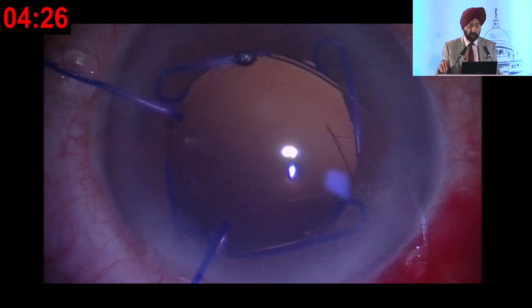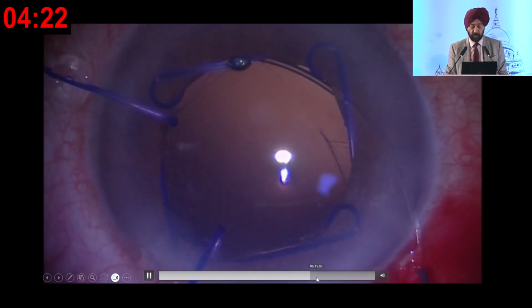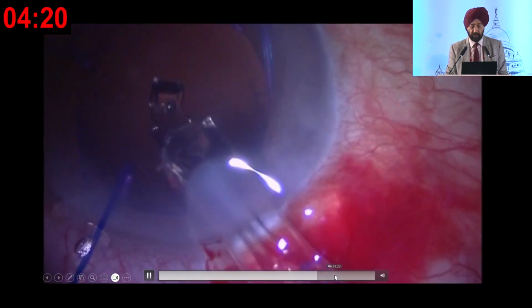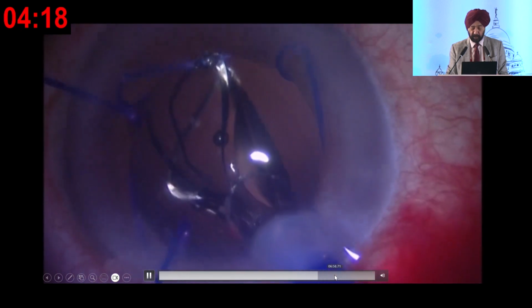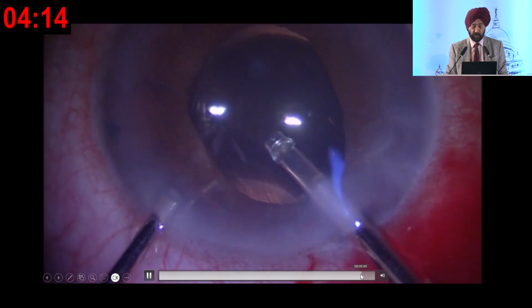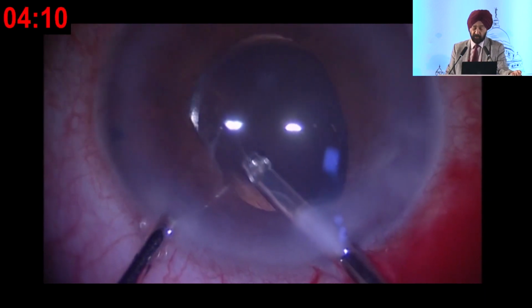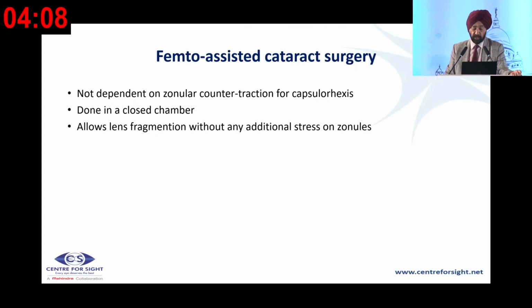So you need to be careful or be sure of your surgical technique as to whether you need a CTR to be put at that particular time, and this is the injection of the lens to give you a good outcome. A 3-piece lens could have been done, and then you can see a vitrectomy is being done if there is any residual vitreous.